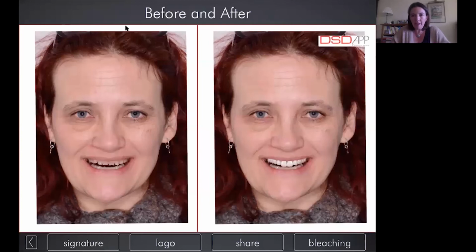You can involve your patient in choices such as the size of teeth, the different shapes. So if there's pictures of them when they're younger, if they've got relatives that have similar shapes of teeth, then we can capture those with our intraoral scanners and import those into the library. So there's a whole wealth of ways that we can involve our patients in this procedure.